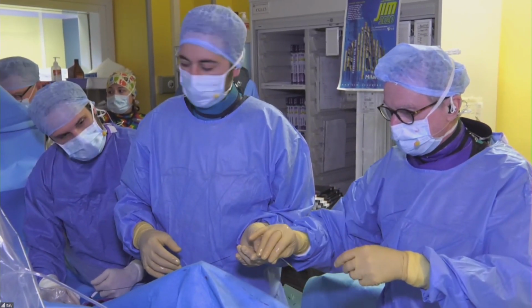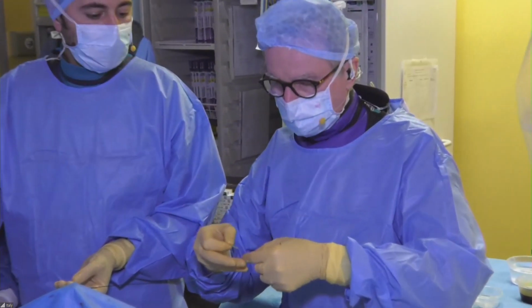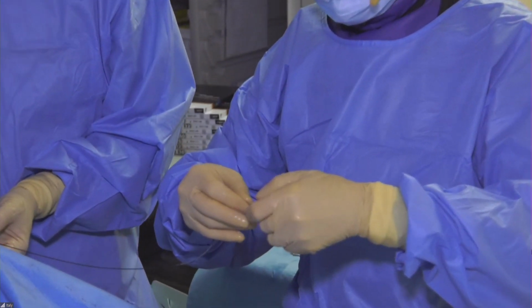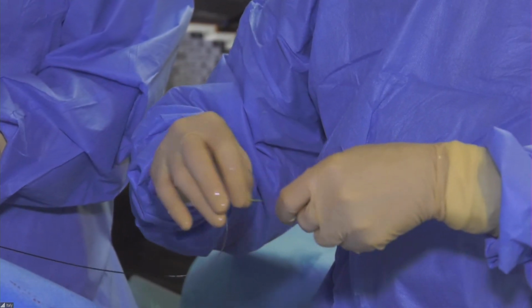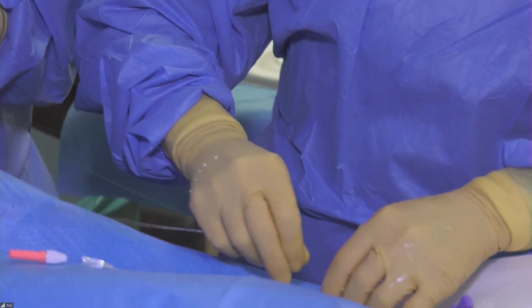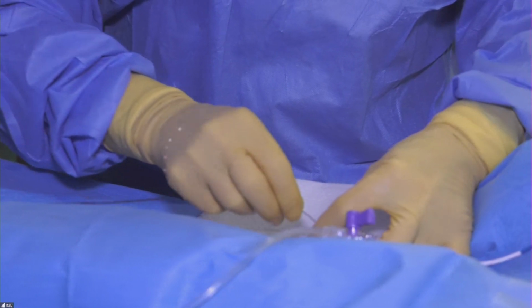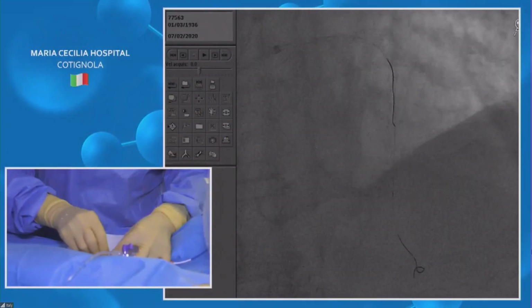So the stent looks pretty good. The stent is good. There's some disease. I leave the wire proximal. So the question is, should you have placed a longer stent? Should you place a stent now? Honestly, I'm more keen not to do anything because of the clinical setting.